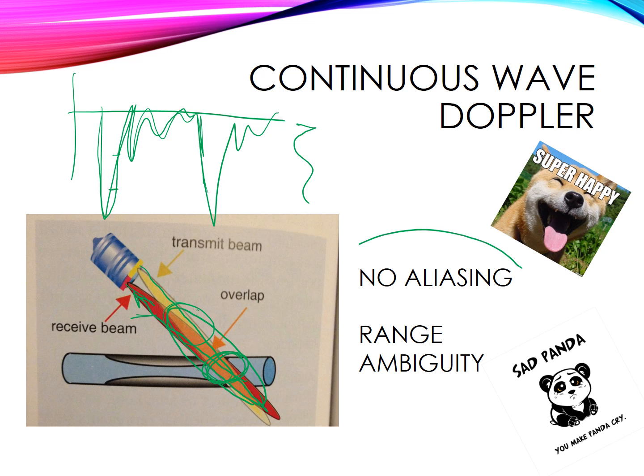The best part of it though is that there's no aliasing. We love continuous wave because there's no aliasing with it.